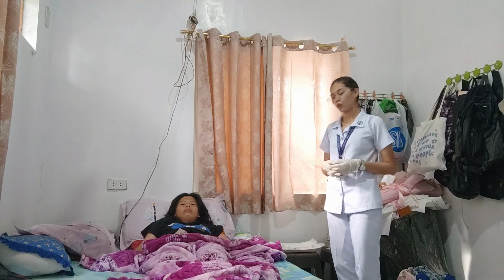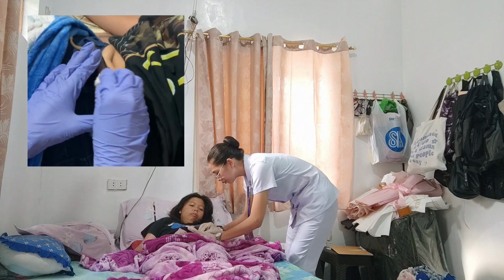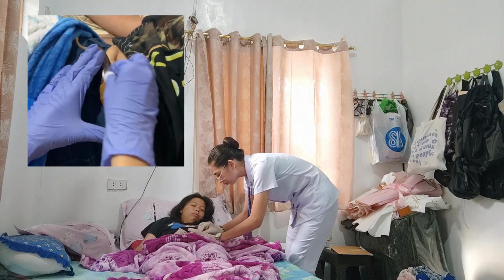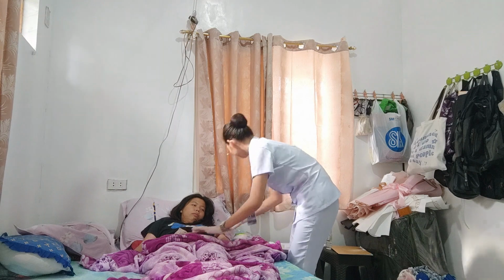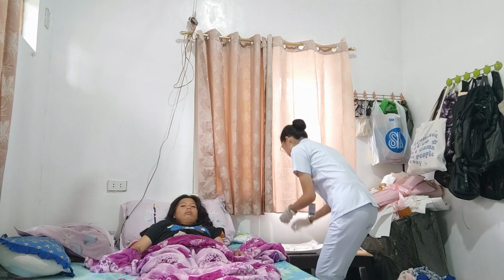Now, we are going to use an antiseptic swab or a cotton ball soaked in alcohol to clean the site starting at the center, circling outwards. Then we're going to dispose the used cotton ball. After that, we are going to get our syringe with the medication, remove the cap, and hold between the thumb and index finger of our dominant hand as if we are holding a dart, like so.